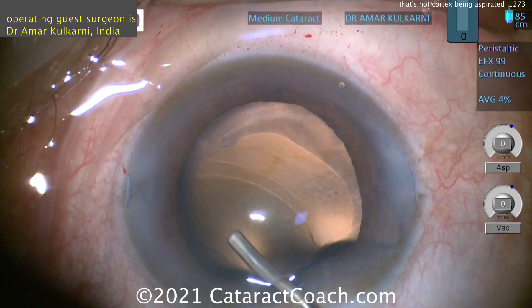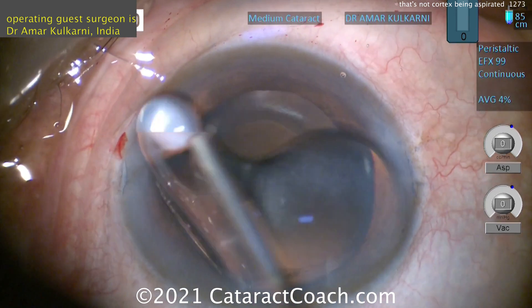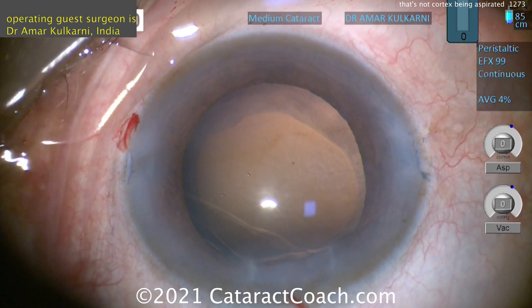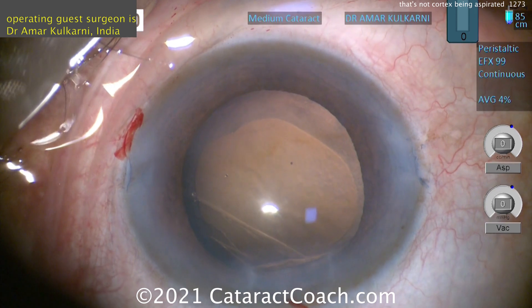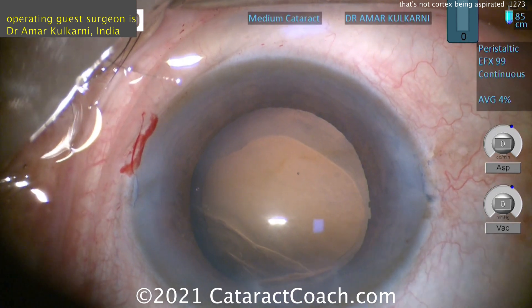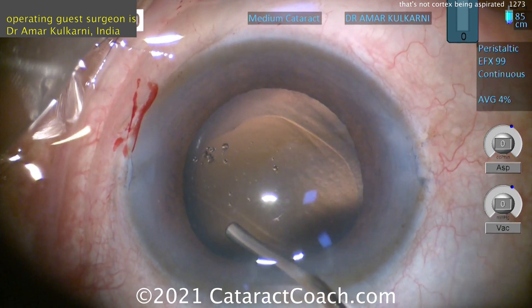You may also want to tell your staff to get the Triamcinolone out. When you're done with this case, put some Triamcinolone there just to make sure you don't have any vitreous prolapse. If you do, you may need to do a little bit of anterior vitrectomy as well. The only way to really tell is to use Triamcinolone to get a good stain of any prolapsed vitreous — it'll also help with post-op inflammation.